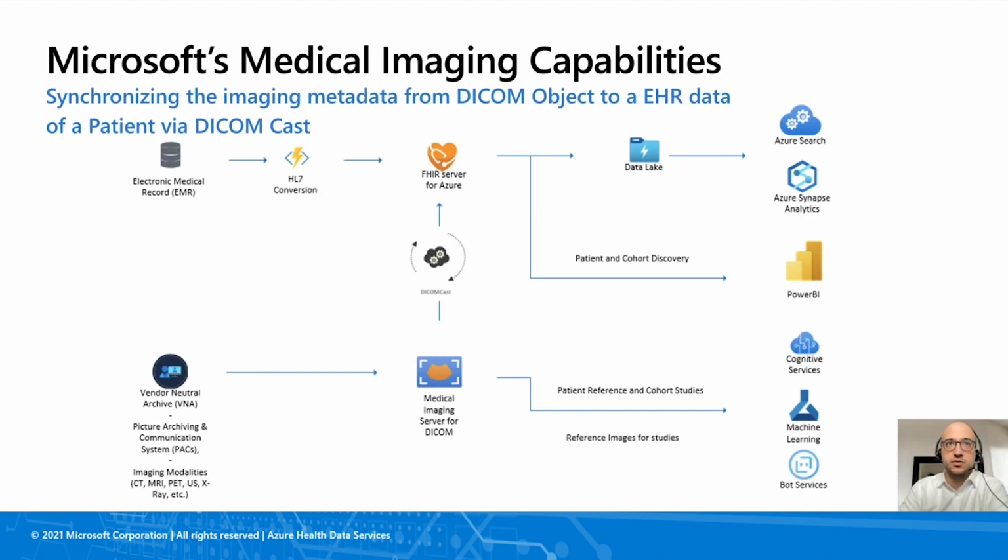Triggered from the FHIR source, but also the images that you have ingested in the medical imaging server for DICOM, or DICOM service, you can also feed to the advanced analytics or machine learning pipeline for your further studies.